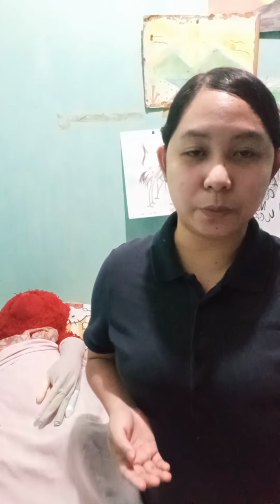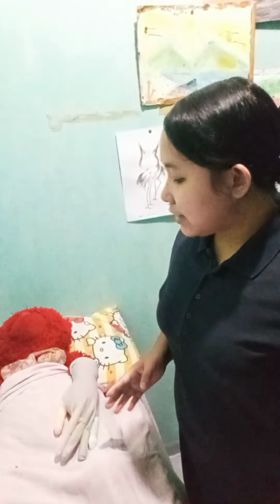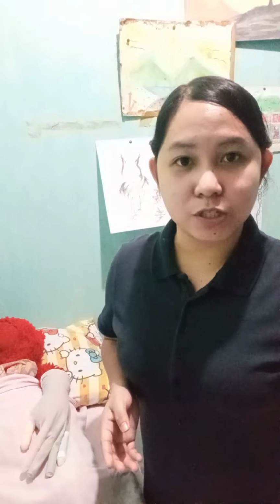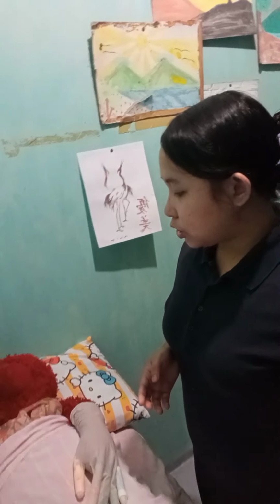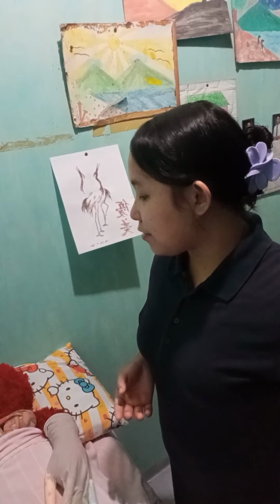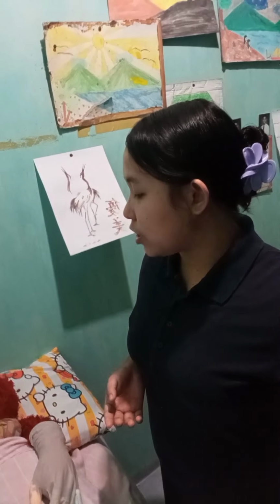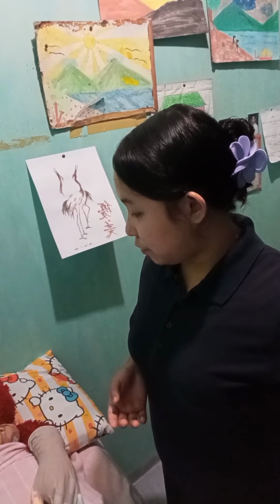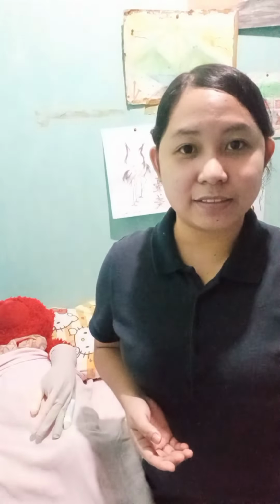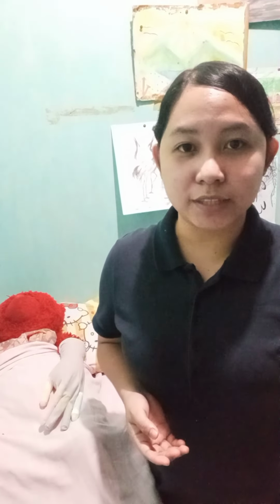And now, after we prepared all the equipment needed for this procedure, prepare your clients and their family by explaining to them the procedure and its purpose of insertion. So, hello Miss Ridber. Today, I'm going to administer IV fluid upon your physician's order for your medication. Is that okay for you? Thank you. After that, place your client in a comfortable position to avoid unnecessary movement during the procedure.